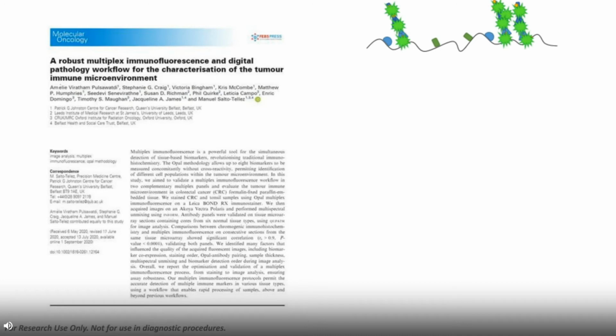And this method, by using fluorescence, allows us to then do repeated rounds of staining by applying heat to remove the previous round of antibody staining, but leave the precipitated immunofluorescence present on the slide. This allows us to go back in the second round of antibody staining with the primary and the secondary, develop a different color, and repeat the process again, so on and so forth.